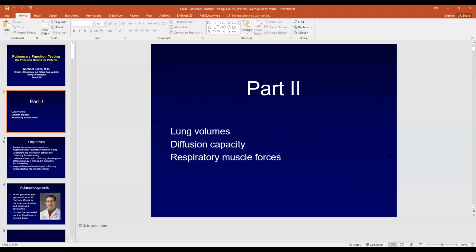Yeah. Mike, is there a reason why we don't report the confidence intervals on our report and we just flag red and black whether the value is abnormal or not when we're not following percent predicted? So the confidence intervals are actually reported, but indirectly. There's a document on HFH Pulm that will tell you what the confidence intervals are specifically, but the more information you put on a PFT, the less likely it is for people to be able to interpret it.